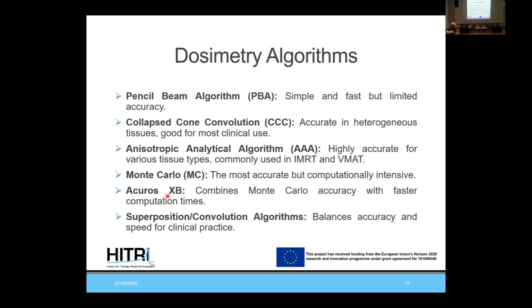Collapsed cone, as you can see. The problem here is that we have to think about the heterogeneous tissues. This is very important.